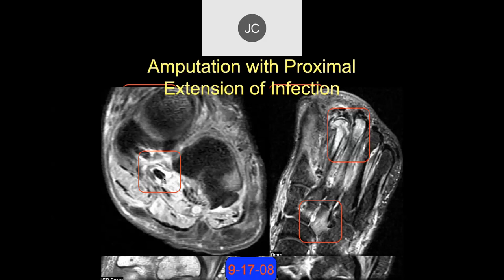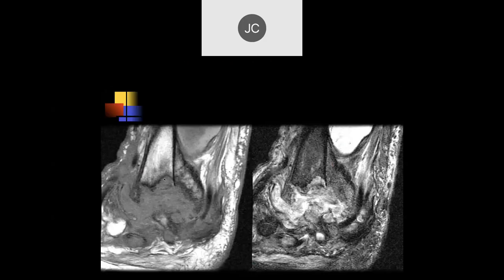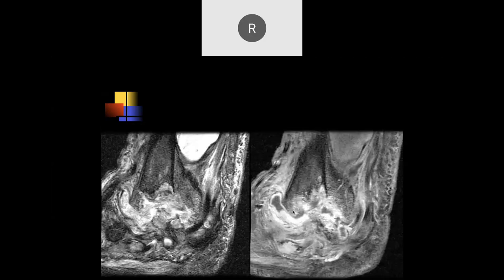Looking at the hindfoot, there's a lot of destructive change. You don't see much of a calcaneus or talus — this is all abscess and phlegmon. If you give contrast now, there's something going up proximally that is concerning.